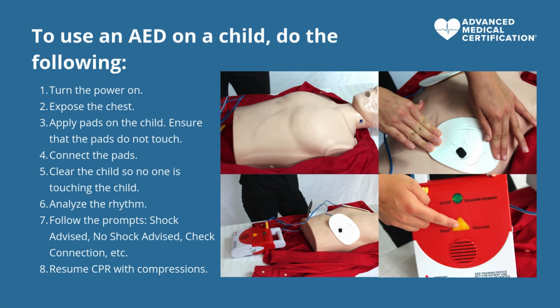To use an AED on a child, do the following. Turn the power on. Expose the chest. Apply pads on the child. Ensure that the pads do not touch. Connect the pads. Clear the child so no one is touching the child.